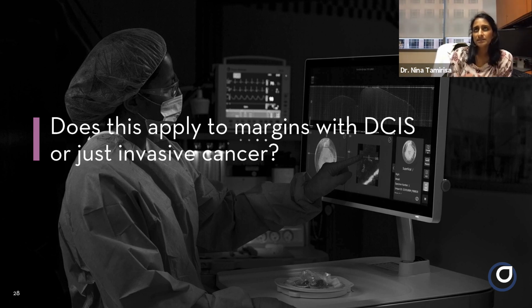And the other instance in which it really helps is in patients who you're really not sure about the extent of DCIS. You have a diagnosis of DCIS with a large degree of surrounding calcifications, but the patient really wants breast conservation. So during the time of the surgery, if you know that your primary specimen contains DCIS, you take an additional shave and that may contain DCIS.